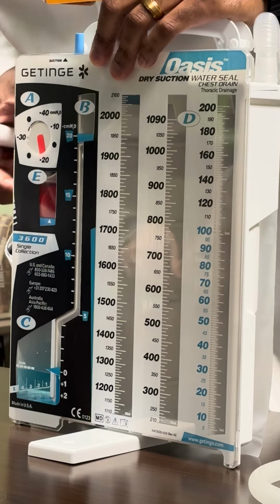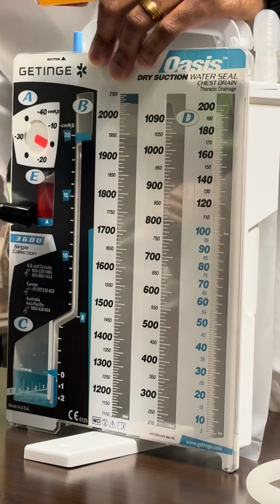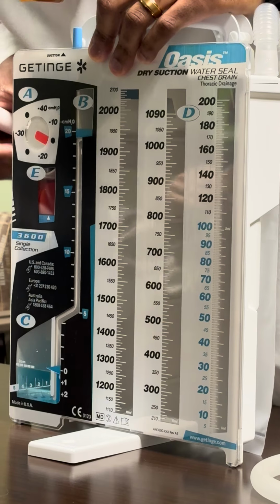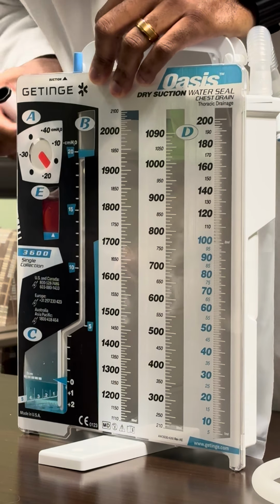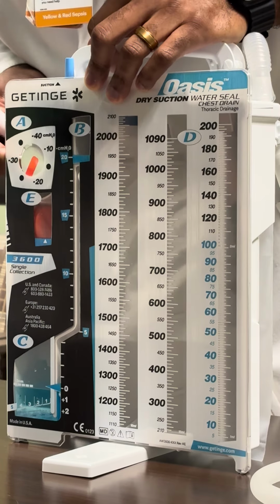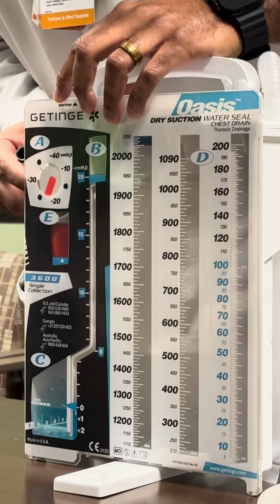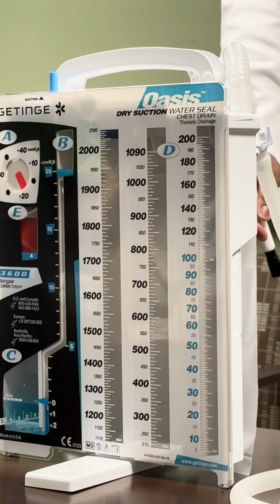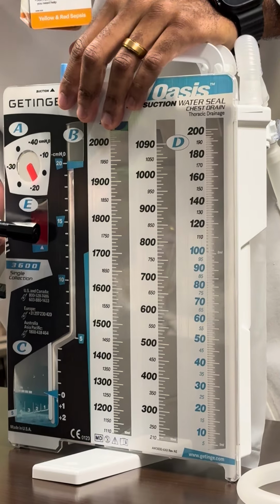So if I set it lower over here, that bellow may not come all the way out to the arrow. If I set it higher to negative 30, negative 40, that bellow will come out. I'm having trouble. There it is. If I set it higher, the bellow might exceed that arrow. If I don't have enough wall suction, that bellow may not reach that arrow either, okay?